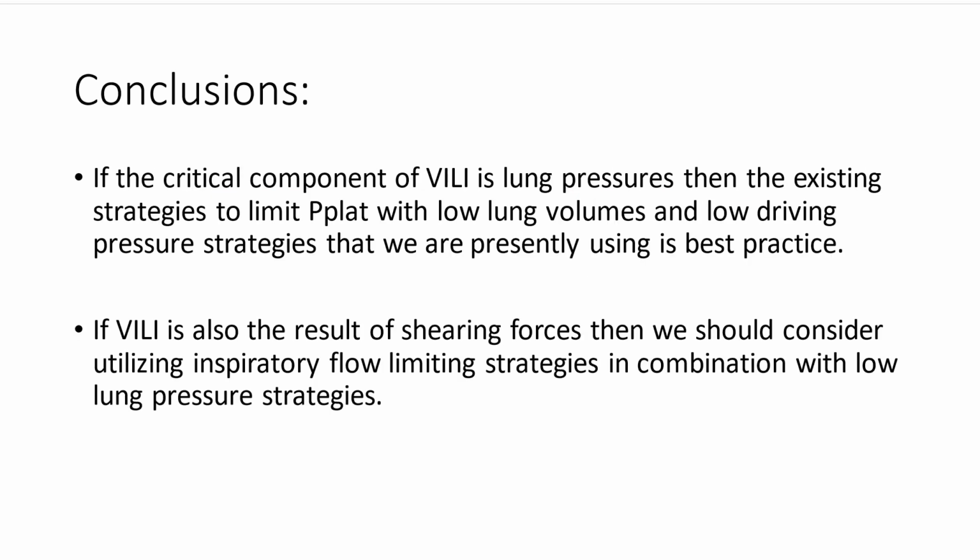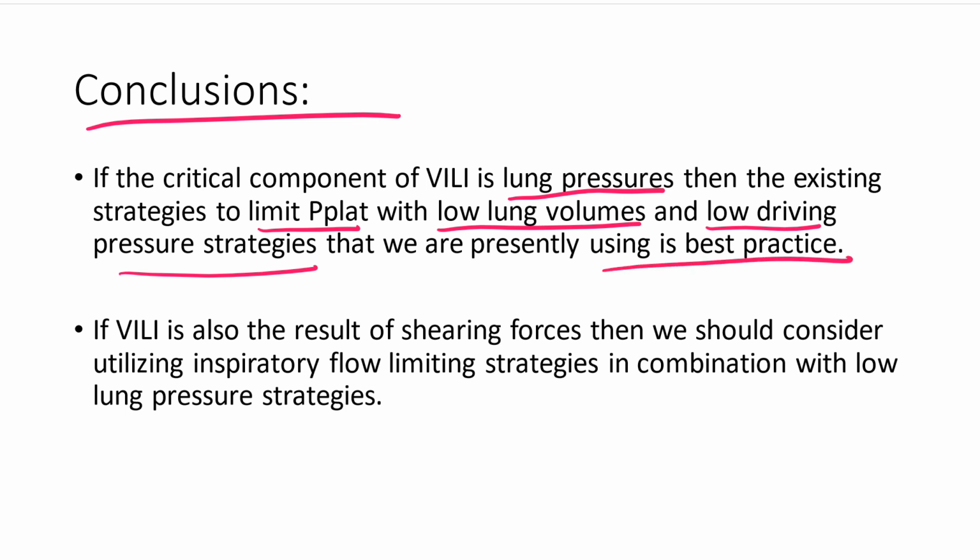So some of the conclusions that I'd like to make today: if the critical component of ventilator-induced lung injury is lung pressures, then the existing strategies to limit lung pressures, with low lung volumes and low driving pressure strategies, are our best practice. But I think we can contribute to that discussion a little bit if we consider that ventilator-induced lung injury may also be the result of shearing forces, and there are several authors you see in the references that are discussing that point.